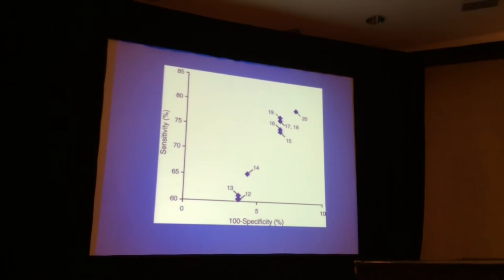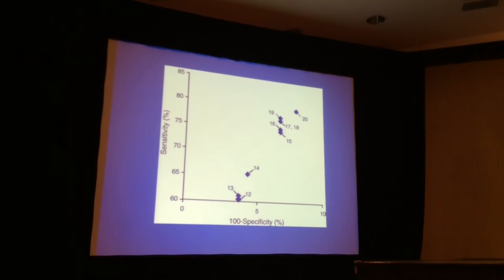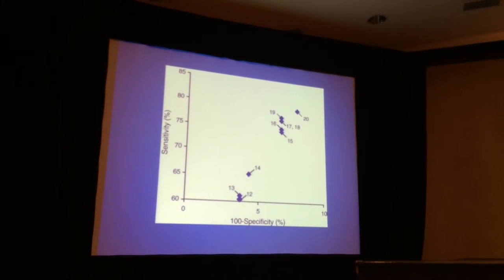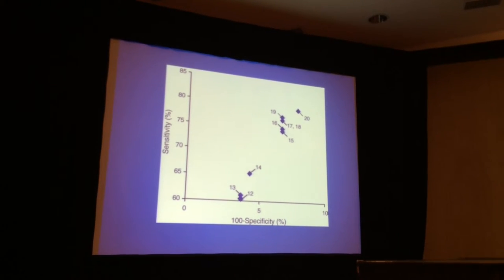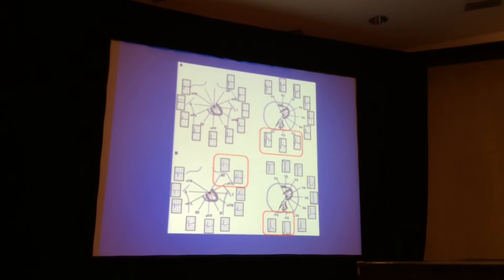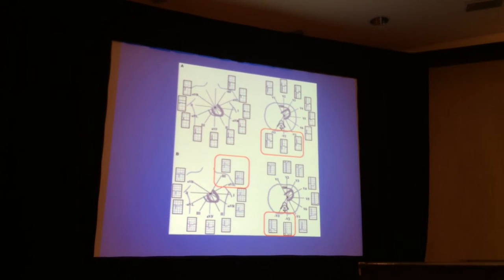As you add beyond 12, of course the maximum is 24, you really begin to increase sensitivity up to 70-some percent. And you decrease specificity a bit, of course, but only down to about 93%. As you go beyond 19, however, you now begin to decrease specificity without further increasing sensitivity. So we then arrived at the concept of 19 leads, 19 views, that would be potentially useful. And that would leave out, would have gaps, because consideration of those views would potentially decrease specificity without increasing sensitivity. Here we have two examples.